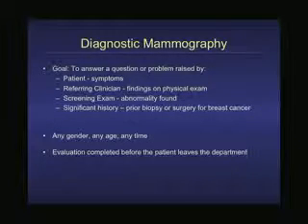Now, diagnostic mammography, there's a different goal. There's usually some sort of problem or question that needs to be answered. That can either be because the patient feels something, a lump, the doctor feels something when they examine the breast, or we see something on that screening exam that doesn't look quite right. So now we're going to bring you back for a diagnostic mammogram.